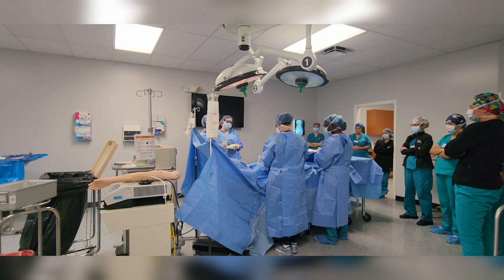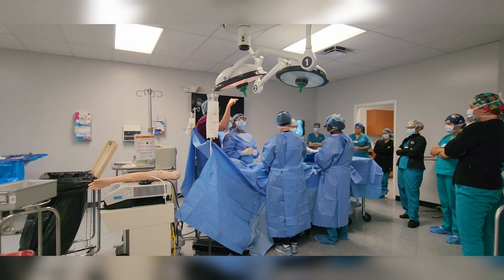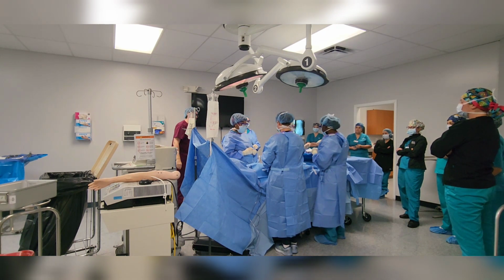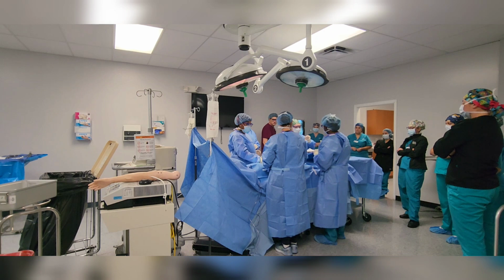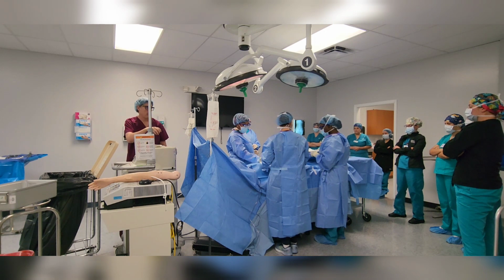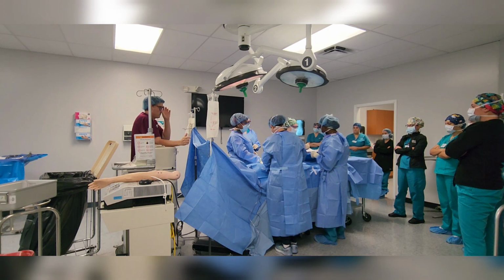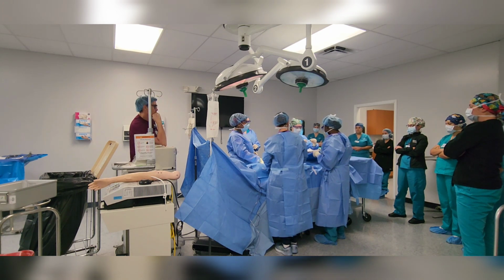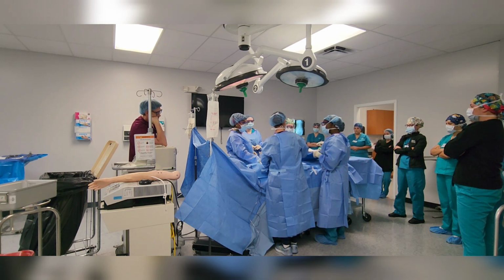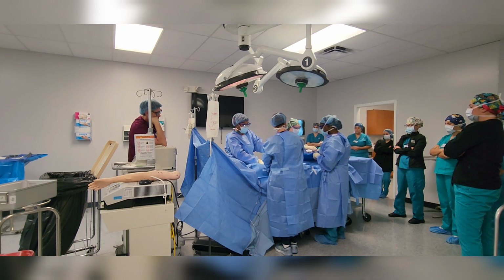I'm not left-handed, so this is very difficult. Okay. Now you're going to hand that back. Then you're going to ask for a retractor. If you see the light, make sure they have the light so you can control this. So you're going to put the retractor in. I'll take a second one. So you want to hold that, Lily? Perfect. Okay. Now they're going deeper. I need a tissue forceps. There you go. Kelly. Remember, you always want to put these on your mayo, ratcheted. Okay. Kelly. Lily, I'll have you grab that.